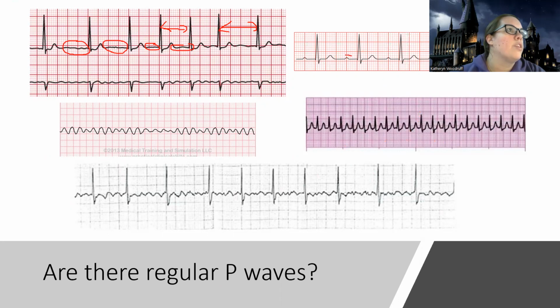Then for this one, let's look at this. P wave, QRS. P wave, then QRS. QRS. So P wave, QRS. I'm not saying that this is a perfectly normal rhythm, but there's a P wave before the QRS, and that's really what we're looking for here. So this one has regular P waves up here. This one is regular P waves. This one is, I'll put IR for irregular.